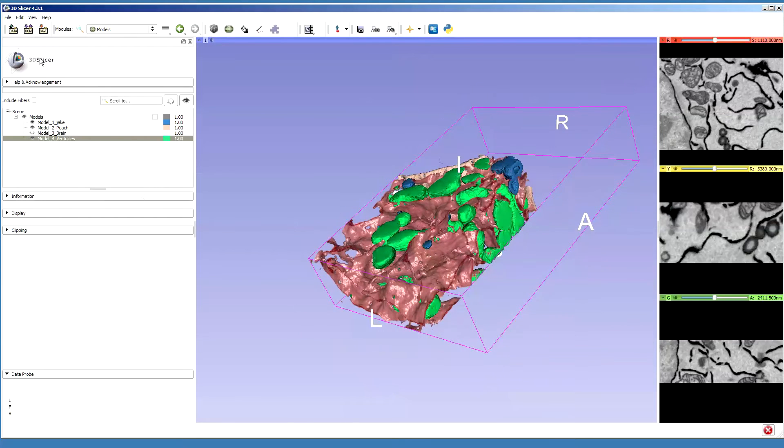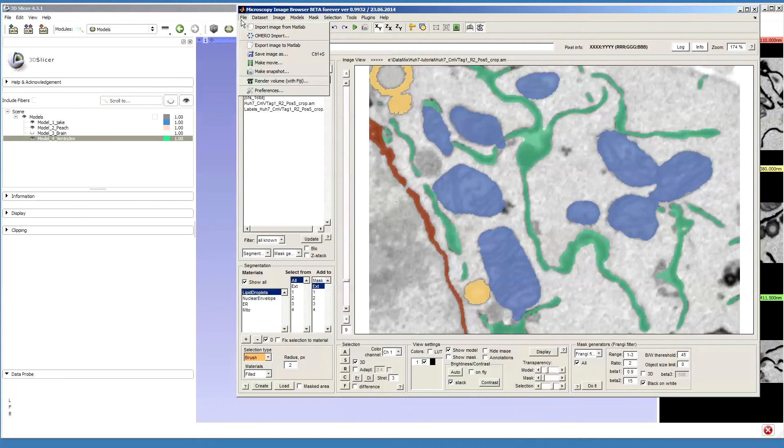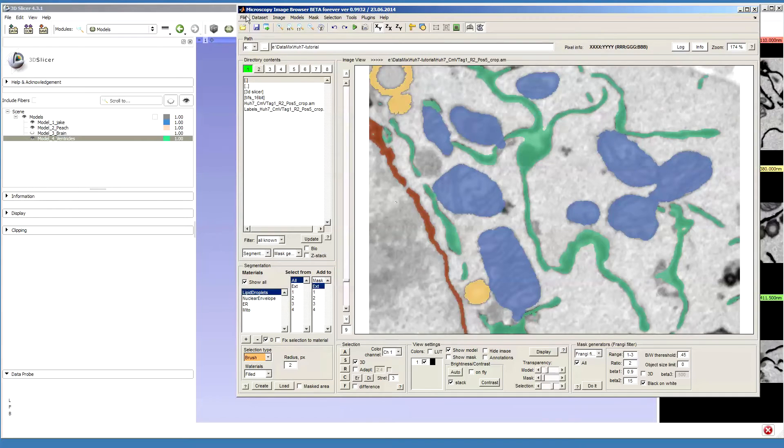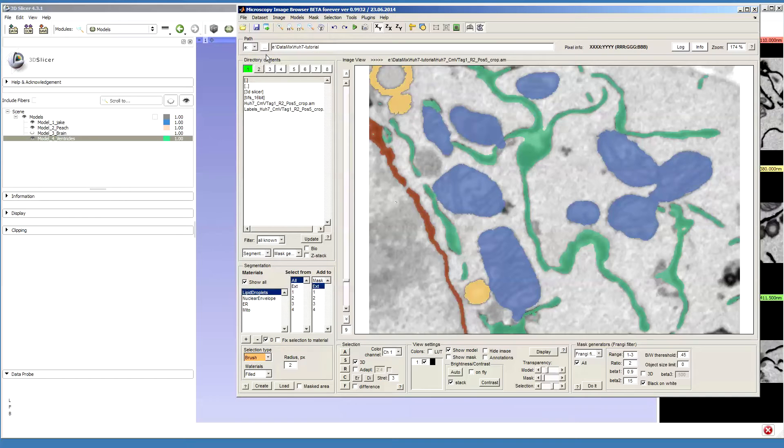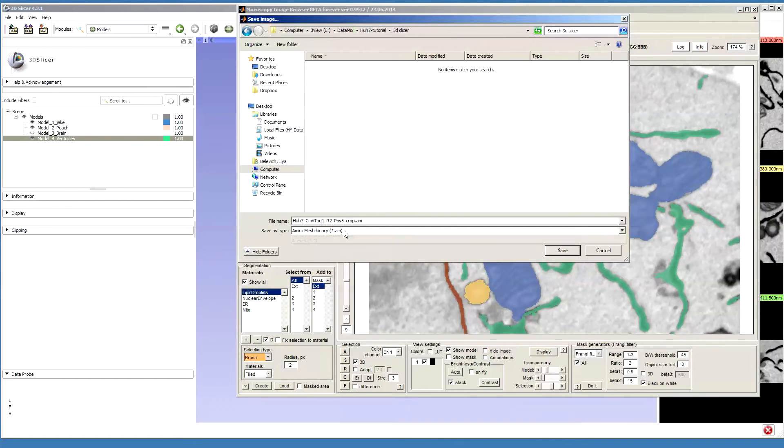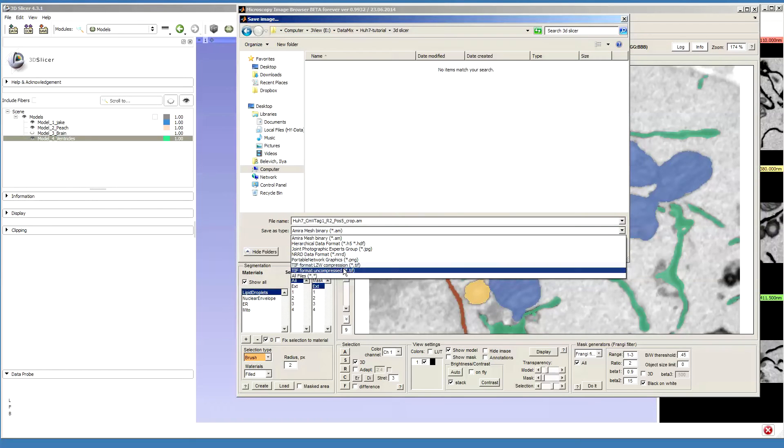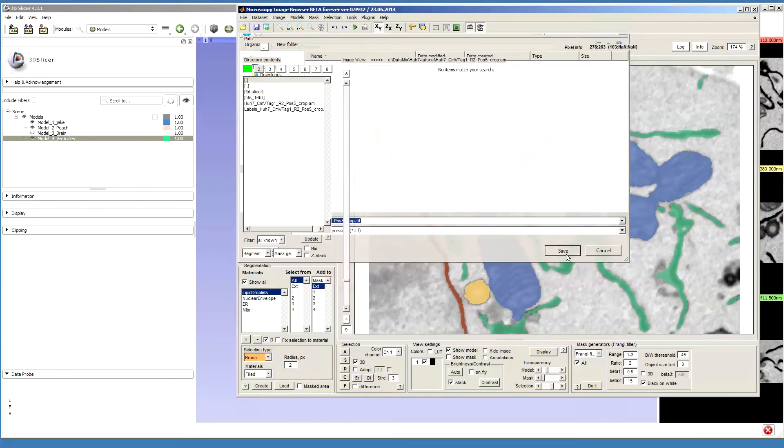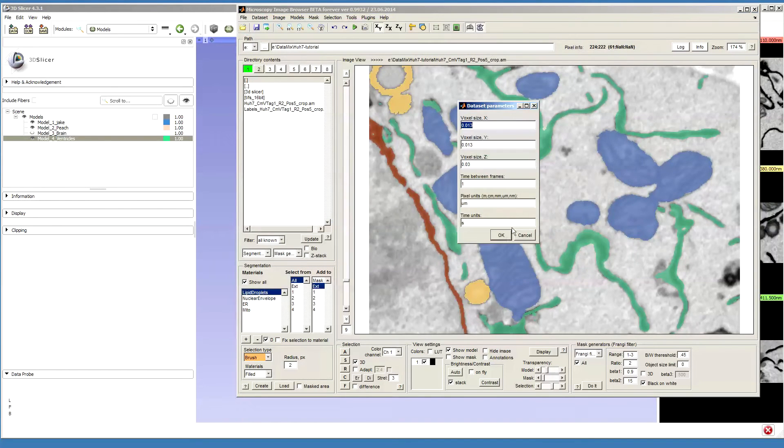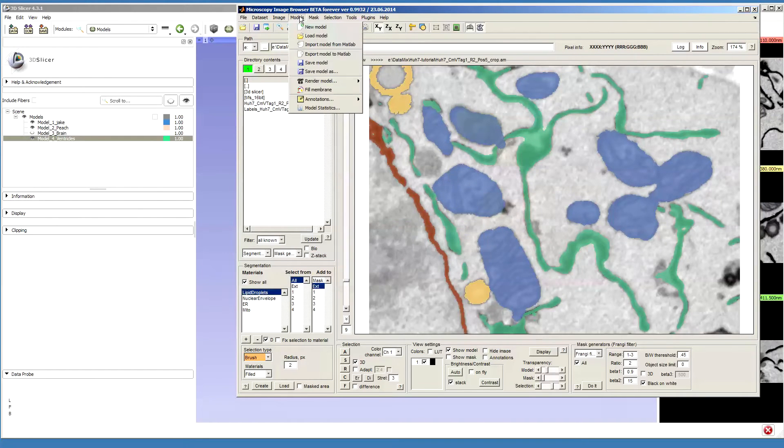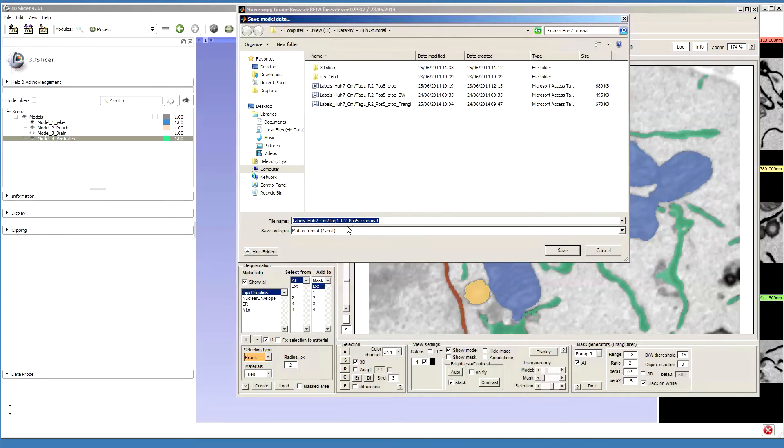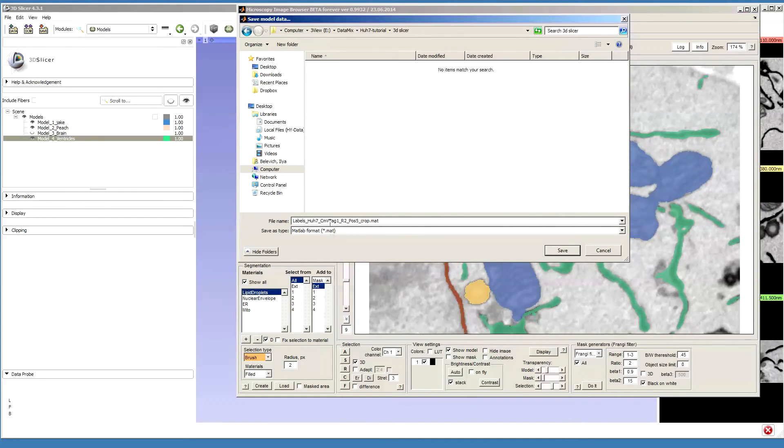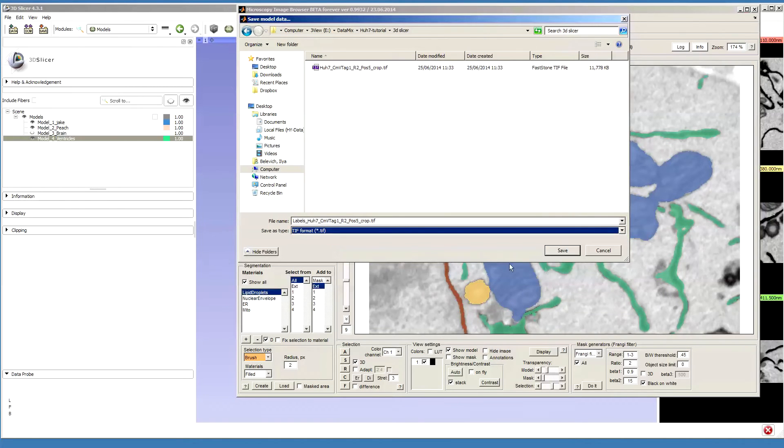Unfortunately, sometimes the saving of this file has some dependencies and it may not work. In this case, the data have to be saved as TIFF. So I go to image browser and I'll save the data in the TIFF format, save it as 3D TIFF, and I'll do the same for the model. Save model S in the TIFF format.